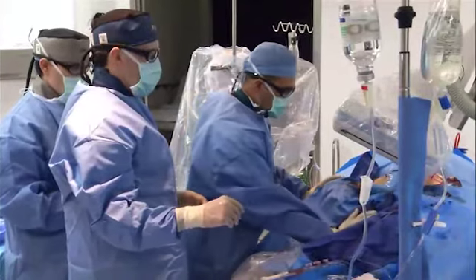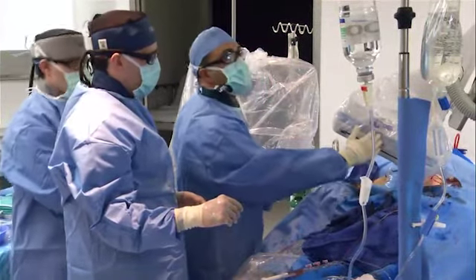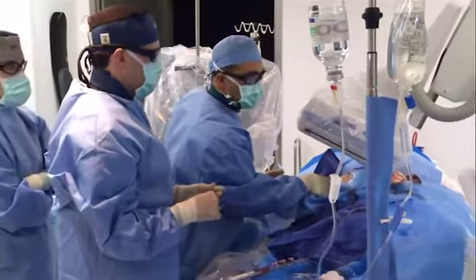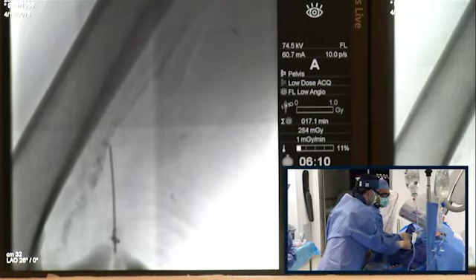So to get the supine popliteal approach, we externally rotate the leg, as you can see here. We then put it in a frog position. As you can see here, the leg is at about a 40-degree angle, like this. The II, you want it to be in the ipsilateral view, so this is about 26 degrees right now. And you want the needle, the vessel, and the II to be in the same kind of view. I have a Cook needle here, and basically we have calcium, so I'm pushing on the calcium.